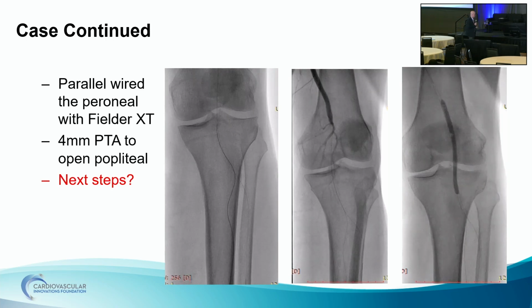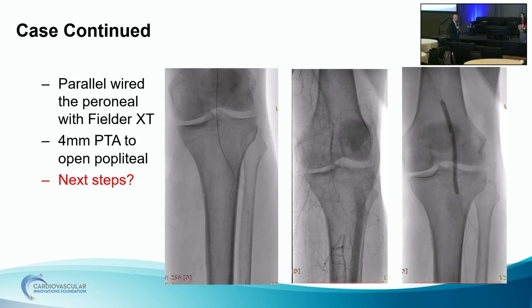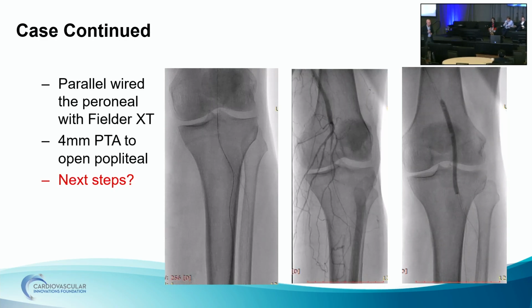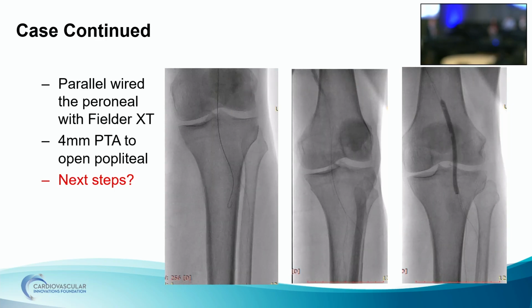Chris, can I push back and ask, you've got IVUS images, what do you want to see in the angiogram? Please, you've got to see it. You take the balloon out and show me. I'll go do IVUS as well, but this patient needs an angiogram right now, and then we can supplement that with an IVUS on a smart map. I just think it's going to give you so much information before you choose your next step. Okay, fair enough. Other thoughts?